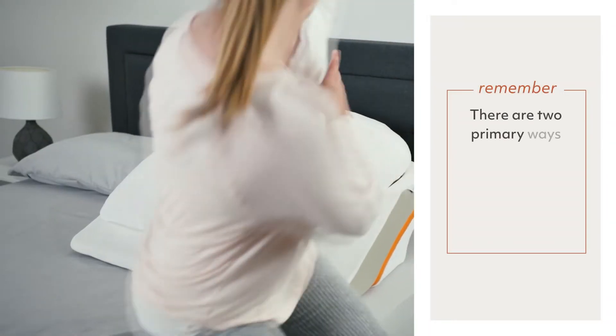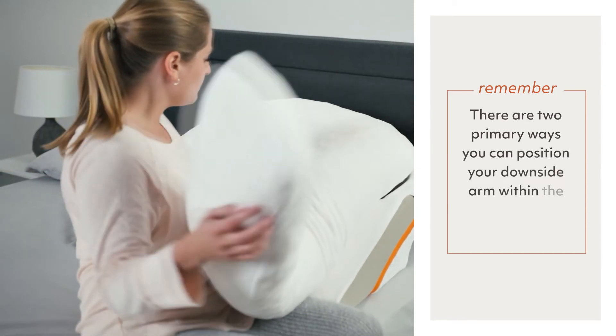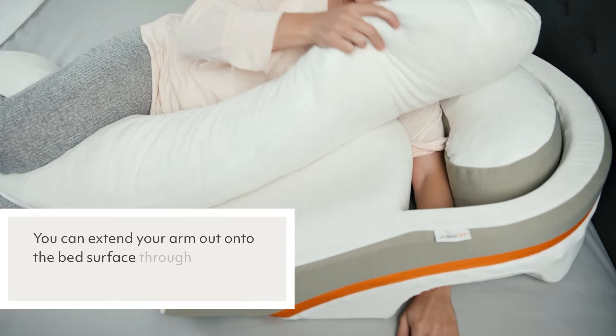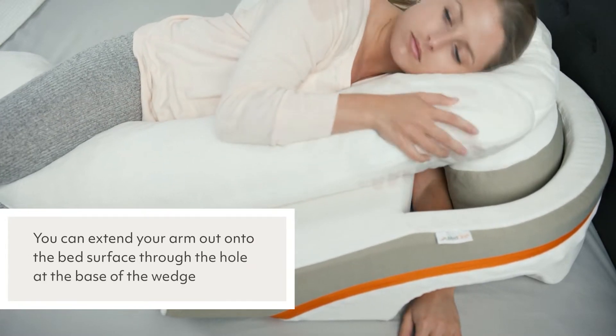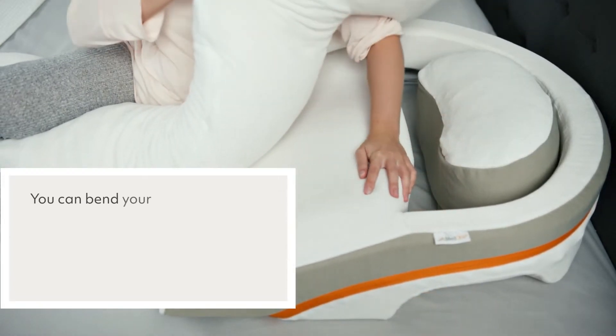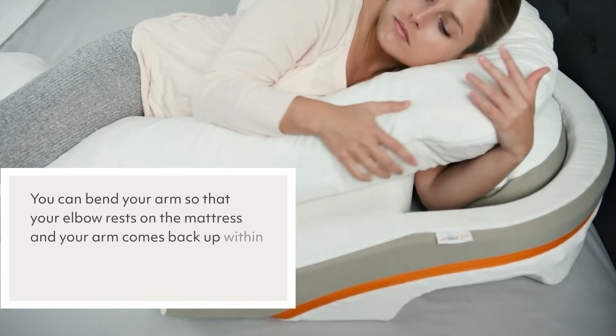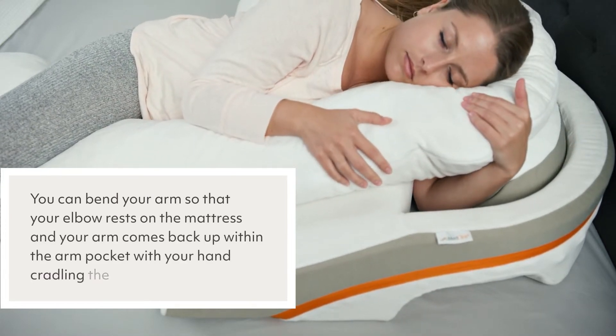There are two primary ways you can position your downside arm within the reflux relief wedge. You can extend your arm out onto the bed surface through the hole at the base of the wedge, or you can bend your arm so that your elbow rests on the mattress and your arm comes back up within the arm pocket with your hand cradling the body pillow.